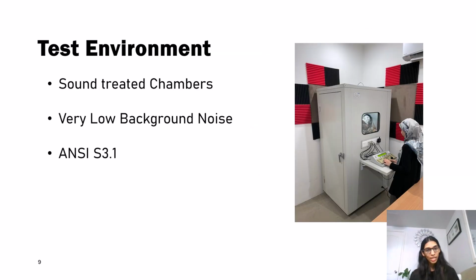Then coming to the test environment, audiometric testings are done in sound-treated chambers or sound-treated booths with very low background noise. We'll have carpeted or sound-treated walls to reduce the reverberation time also. And we follow ANSI standard S3.1 to set up the test environment.